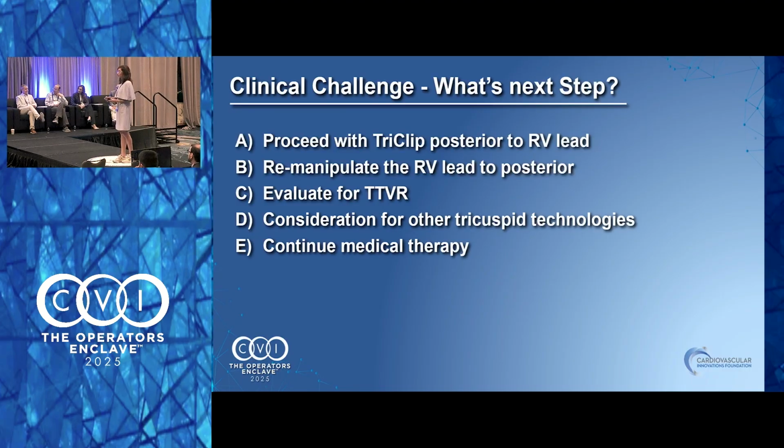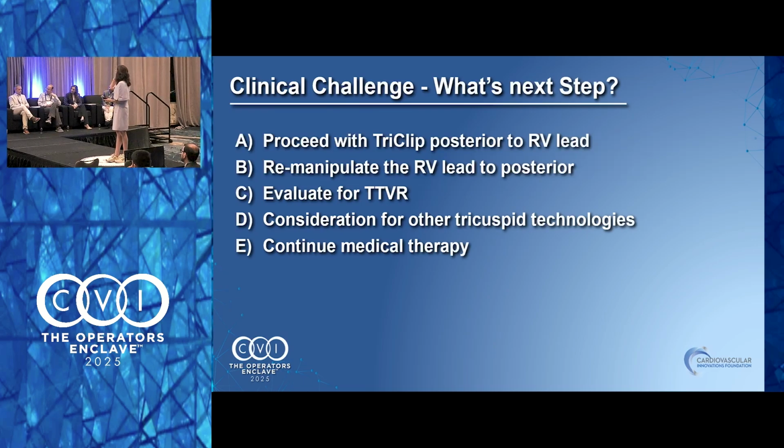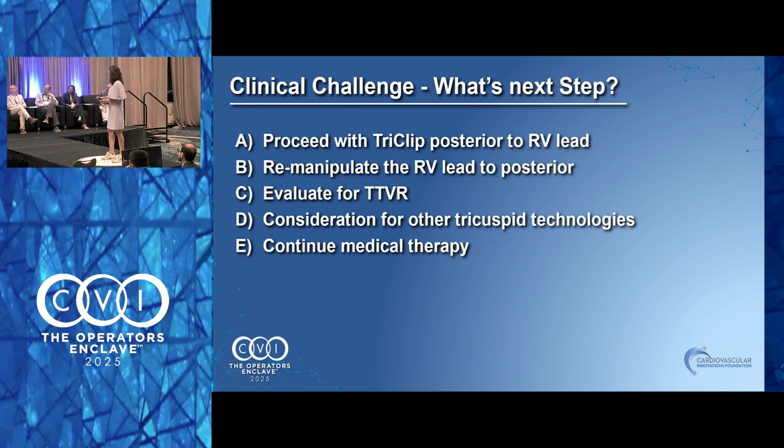Here, we don't deal with the lead. We leave the lead alone, and we have defaulted to TTVR mostly under a lead situation. So you jail the leads? No one complains?